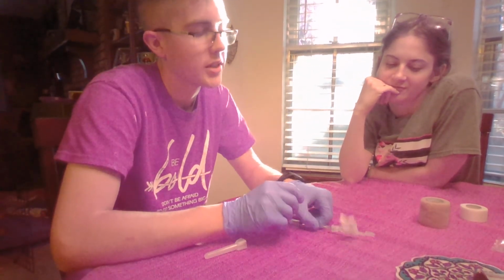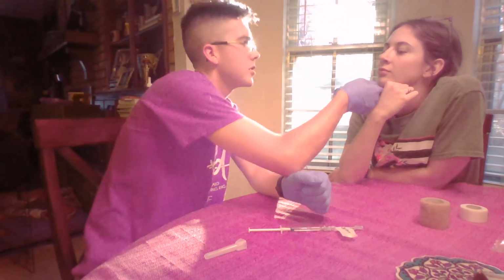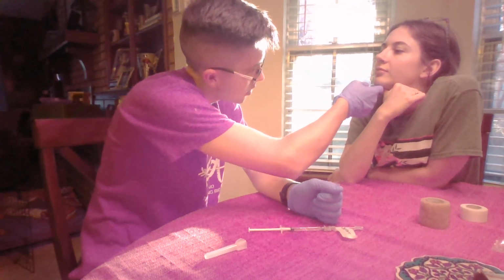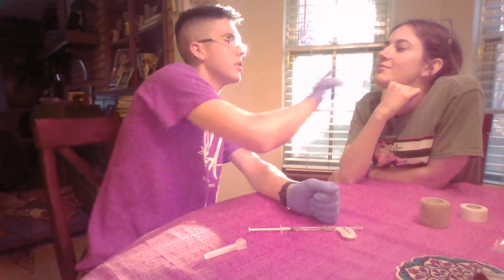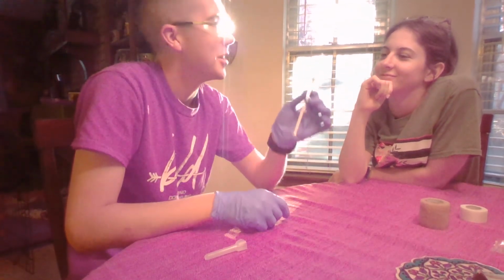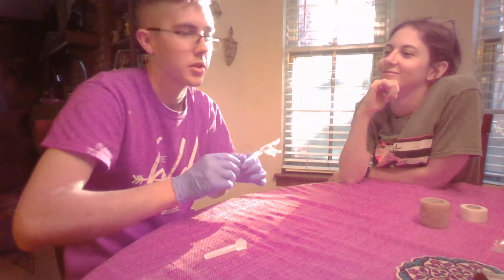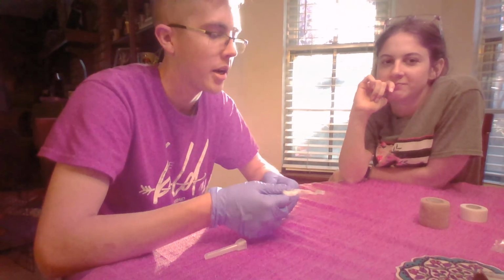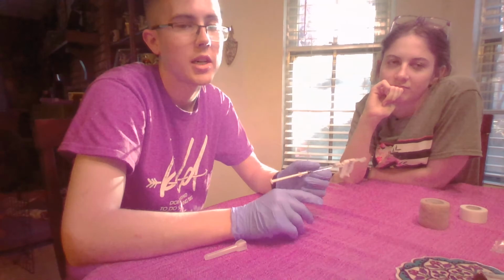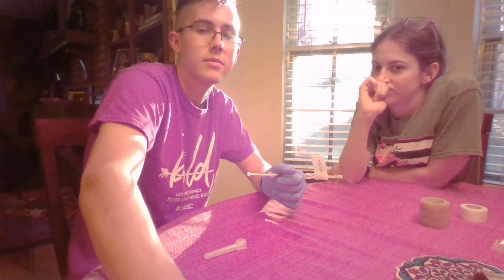If there was any type of ventilation, this is whenever I would cease it, and then I will inspect which nostril is larger, see which one is less blocked. Okay, that would be this nostril. So then what I would do is take my atomizer. I'm actually not going to shove this up your nose, but I would put it up the patient's nose, inject all the medication briskly, and then if they were being ventilated, I would resume ventilations. I would then take this, put it in my sharps container, and then I will observe for any undesired side effects. Thank you.